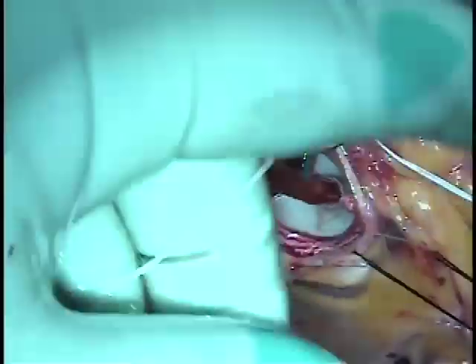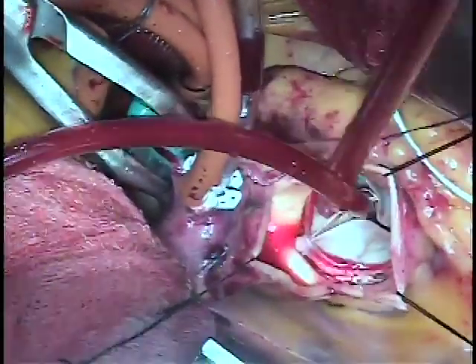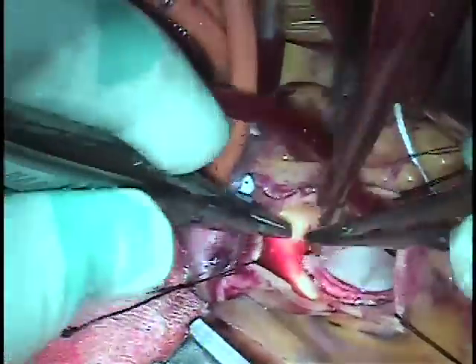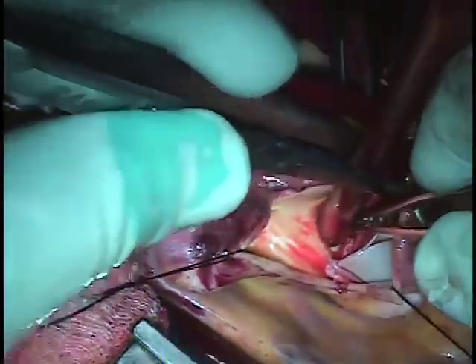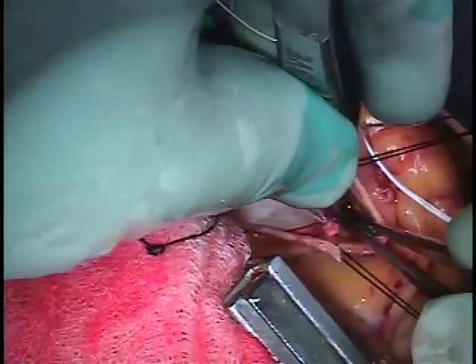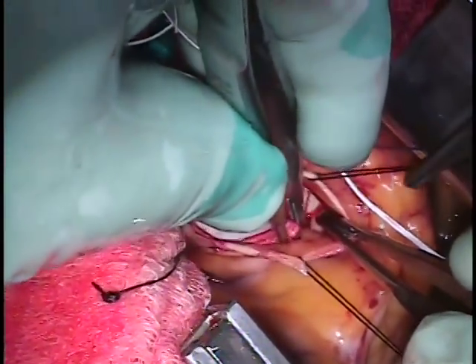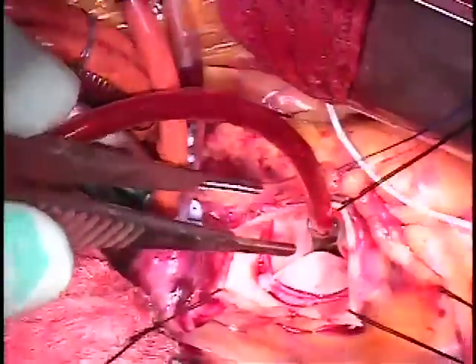Once that is completed, the sutures are all cut and then we check the valve to make sure that the coronary ostia are not obstructed by the new valve. This is a very important step that is often not done during valve replacements and can result in obstruction of the coronary arteries with a heart attack as a result.